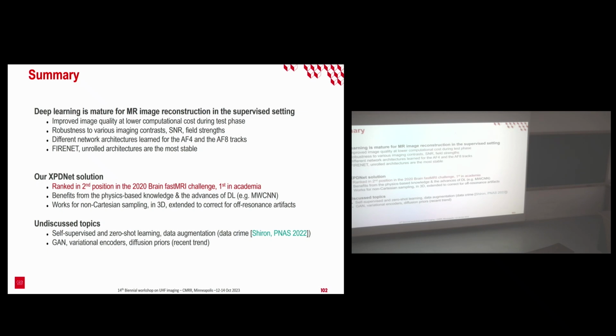For instance, there is a well-known issue, which is training your models with magnitude-only images, okay? MR images are natively complex-valued. You have information in the phase as well. And even for some specific diagnoses, my colleagues who are neuroradiologists are interested, for instance, in what we call SWI imaging, susceptibility-weighted imaging. In SWI, you have a specific processing of the phase information to enhance notably the microbleeds. And this is critical to establish the right diagnosis, in particular when the spots are tiny and it's not a massive lesion, a massive anomaly in the image. I didn't discuss that, but I encourage you to read that paper if you are interested.